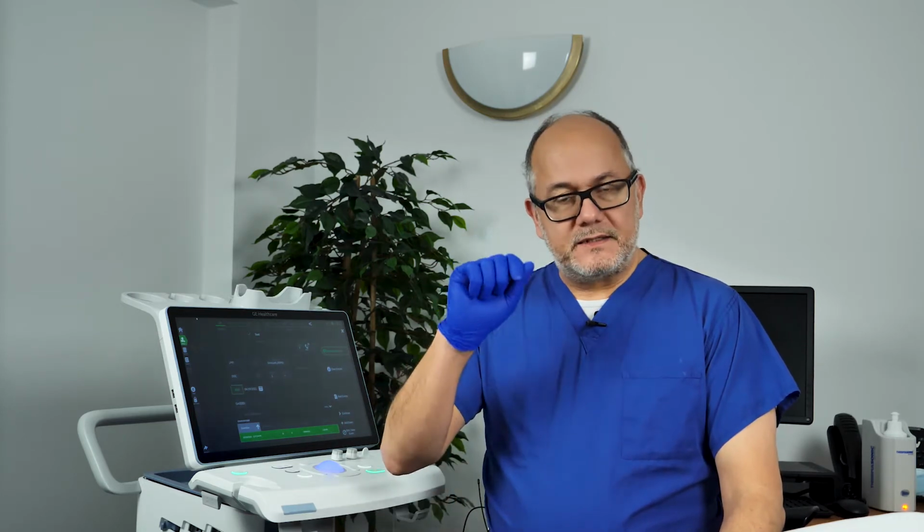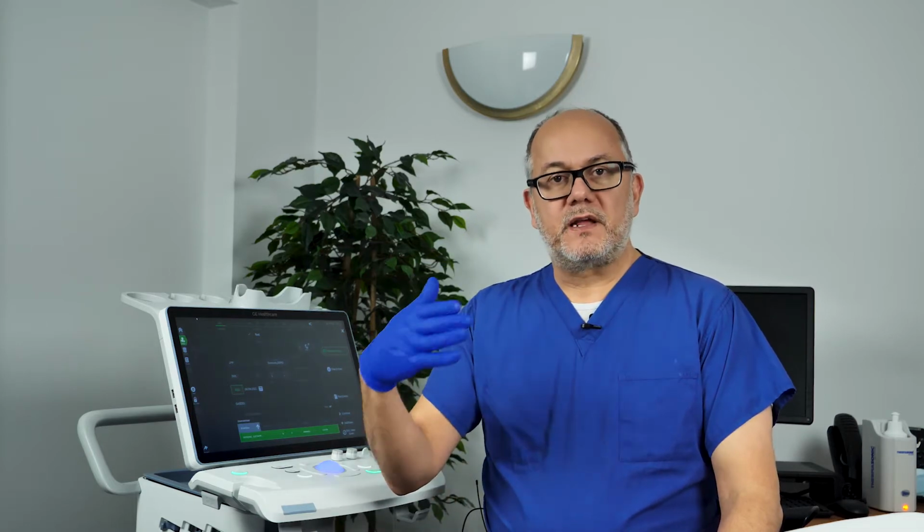The aim of this AI algorithm that sits on this GE machine is to do two things. The first thing it does, it ticks off automatically all the images that are required within a protocol. So as you do your ultrasound scan, it will tick off that it's seen the head, it's seen the lips, it's seen the kidneys, and so on.